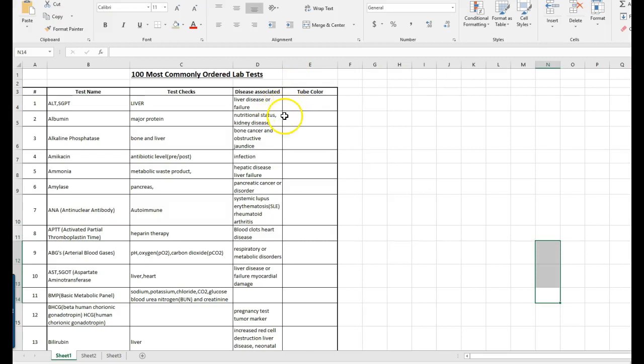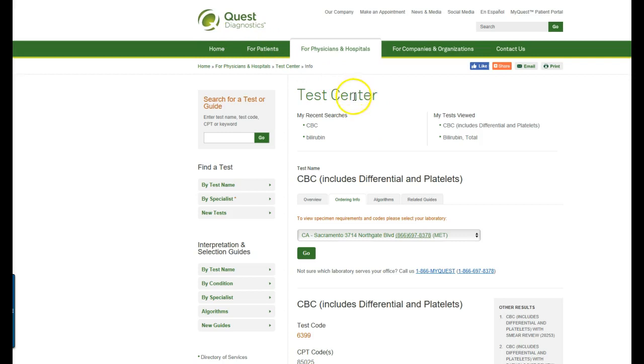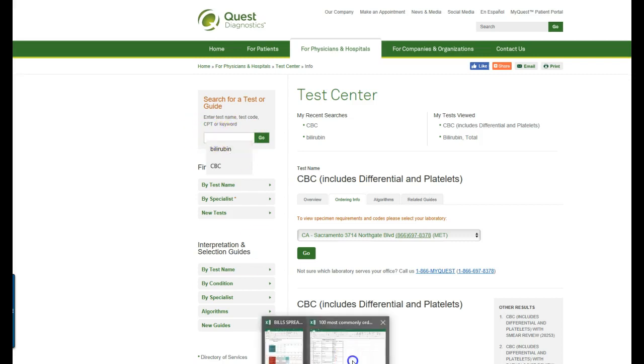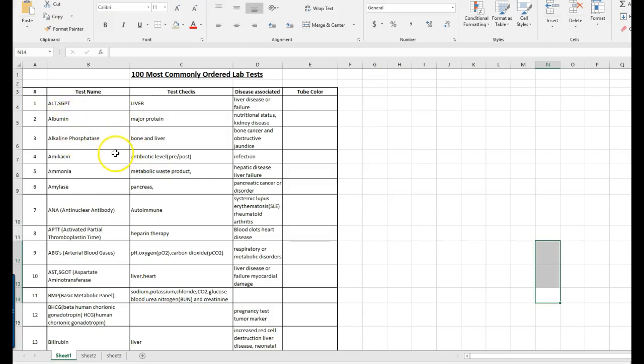So you have your lab test spreadsheet and you are going to go over to the website that's linked in Canvas. It is the Quest Diagnostics test center menu and I'm going to show you how to look up a test. The first one is ALT which is also known as SGPT, and then we have albumin, alkaline phosphatase, a whole list of them, a hundred of them actually.